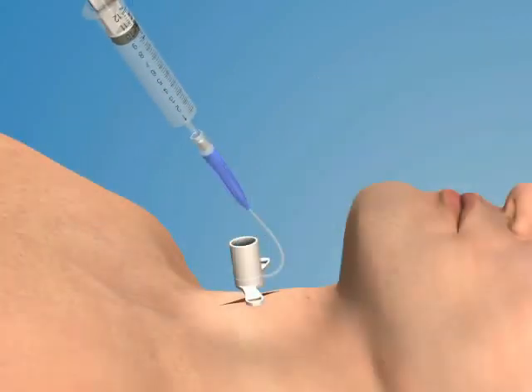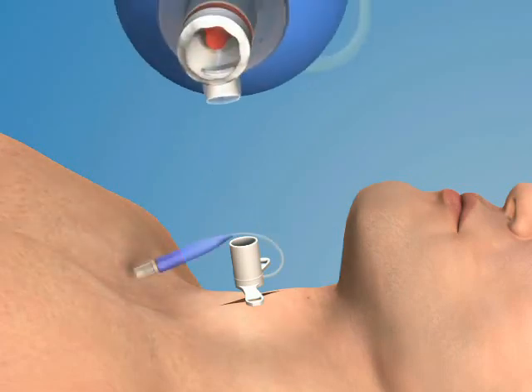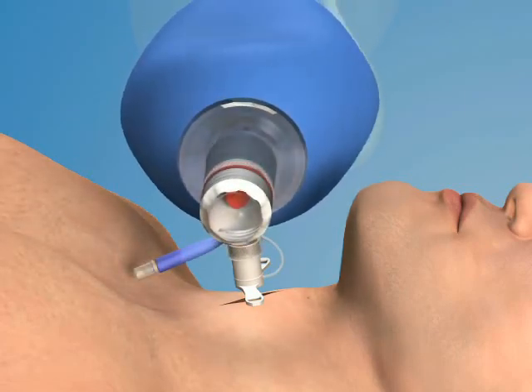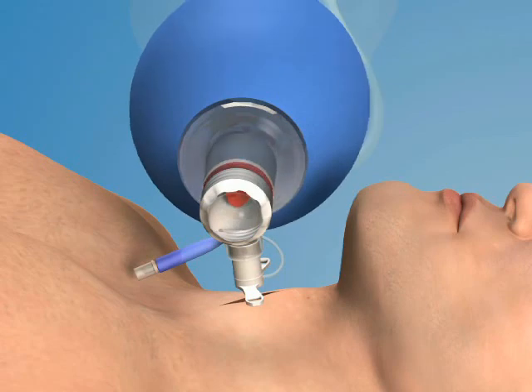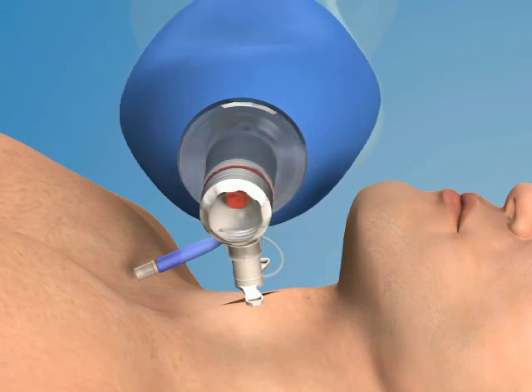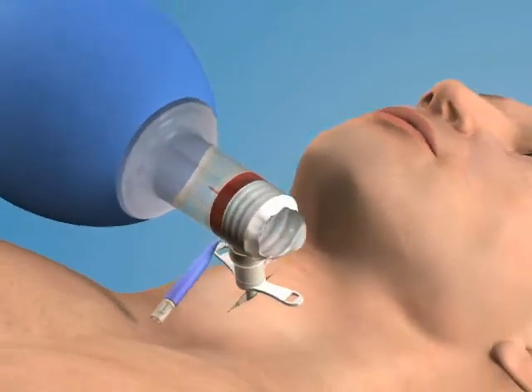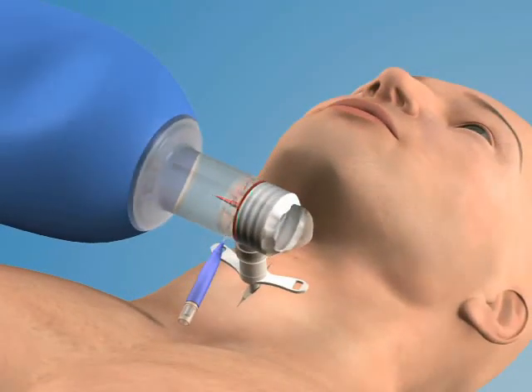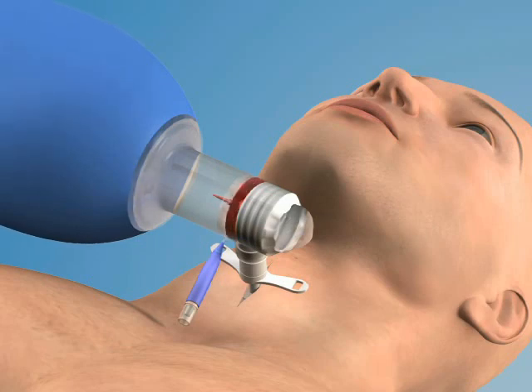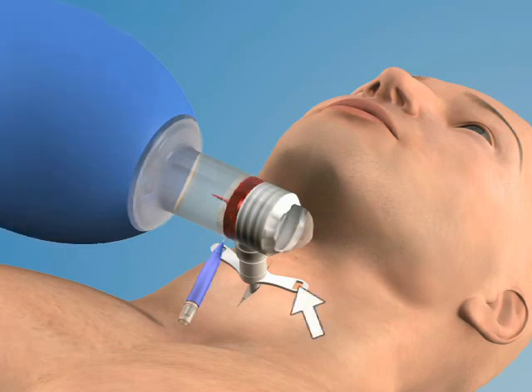Inflate the cuff with 8–10 milliliters of air and then begin to ventilate the patient. Proper catheter placement may be confirmed using auscultation and end-tidal CO2 detection. Secure the catheter using cloth tracheostomy tapes that have been threaded through the flanges of the catheter.